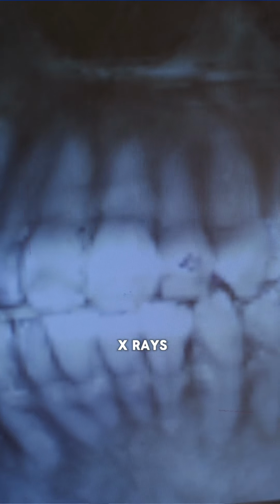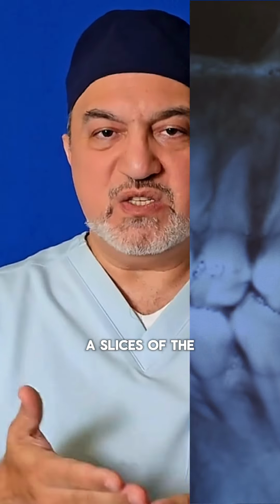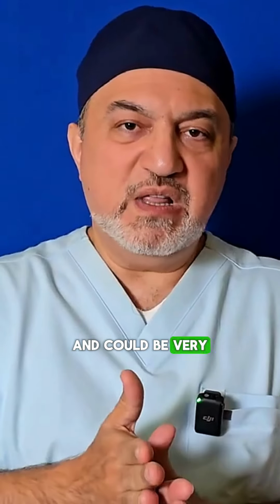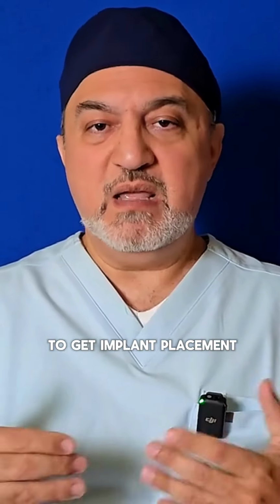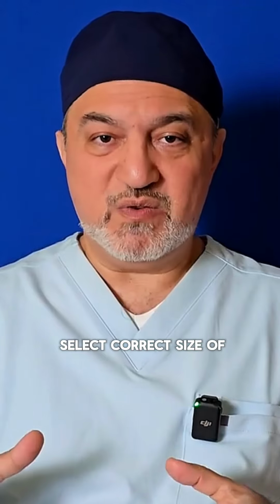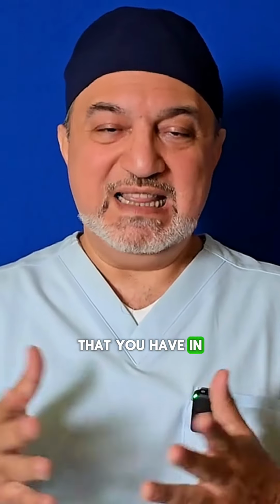This is three-dimensional x-rays that could be used like a CAT scan, right? Slices of the x-ray, different increments, and could be very small increments or larger increments. And those are used to see where the bone is and how wide the bone is. If they were looking to get implant placement, you want enough bone on either side of the implant, so you have to select the correct size of the implant. Right? It depends on the amount of bone that you have in that area.